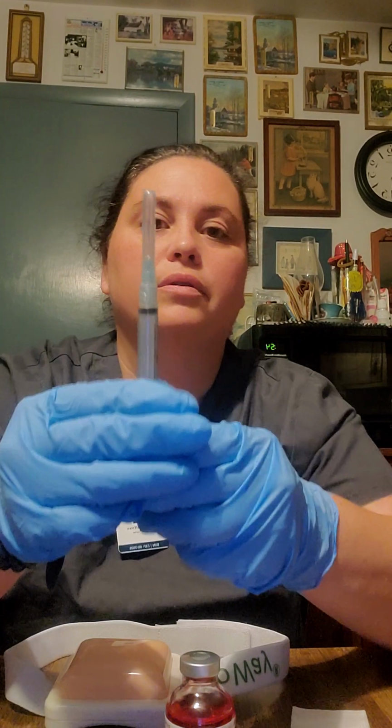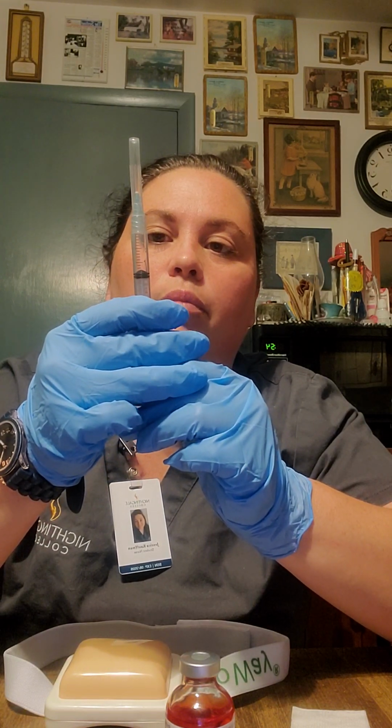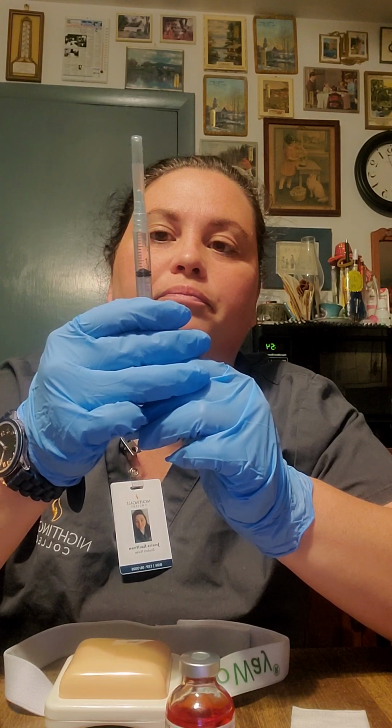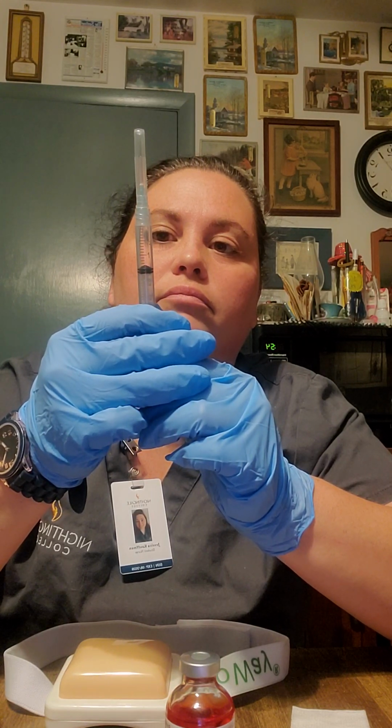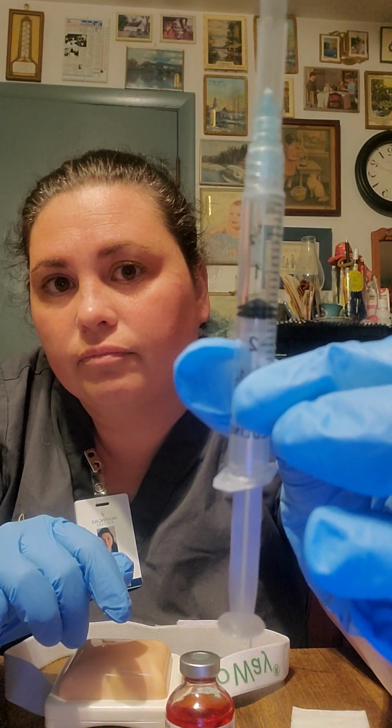So first I'm going to, with the cap on, draw back 1.5 ml. Alright, I'm going to clean my hub of my morphine. I would let that dry. Okay, I can pull the cap off here now. I'm going to inject the air in.